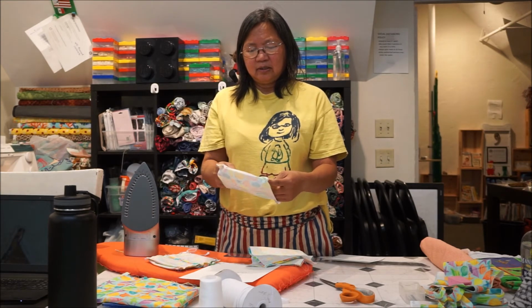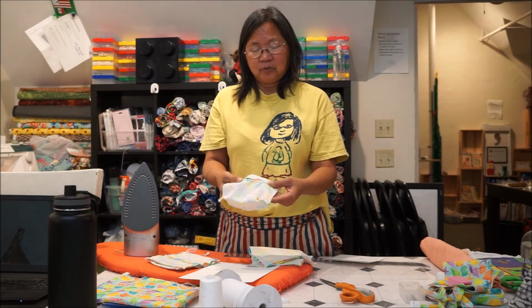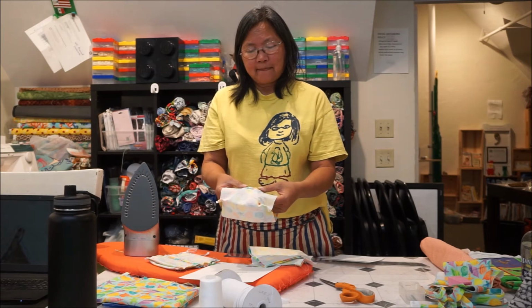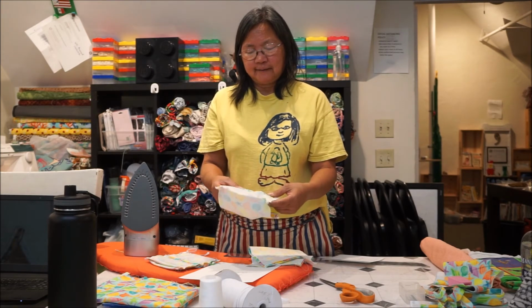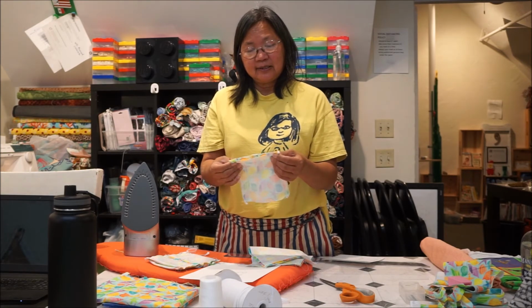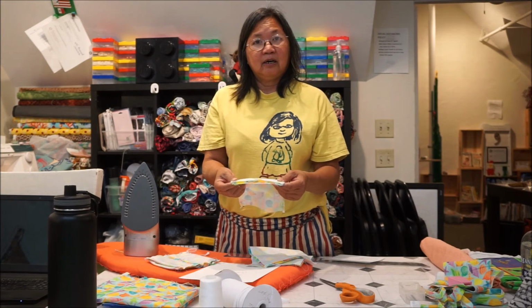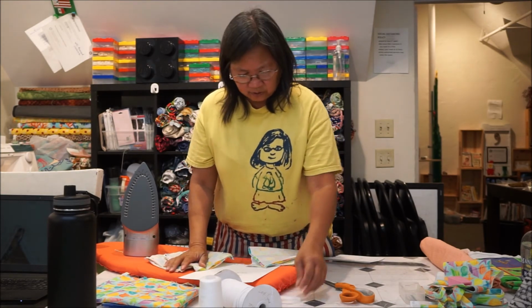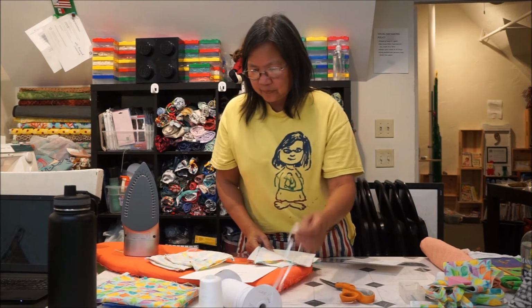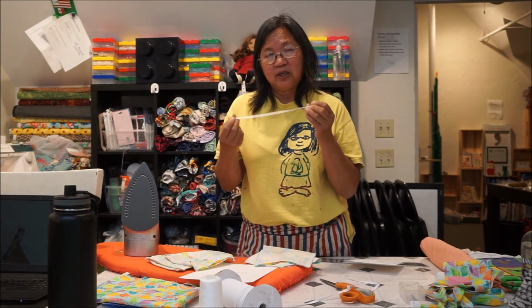So here we have the mask in progress with the seam allowance pressed open and a straight stitch on either side. What I've also done here is I have pinned the elastic on both sides. So for the elastic, we have a piece that is 11 inches long, and we have 2 of them.